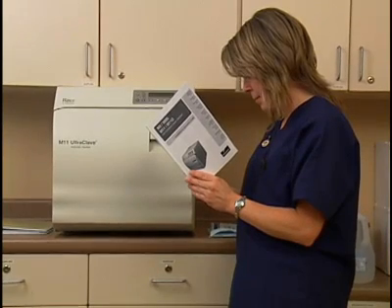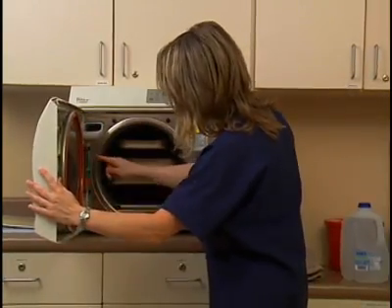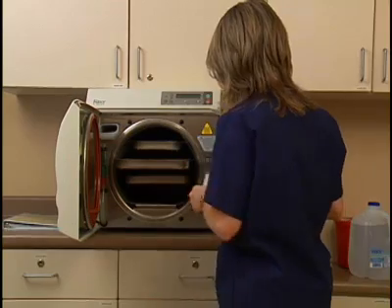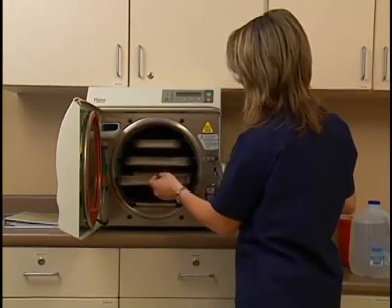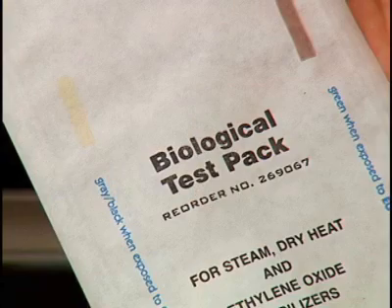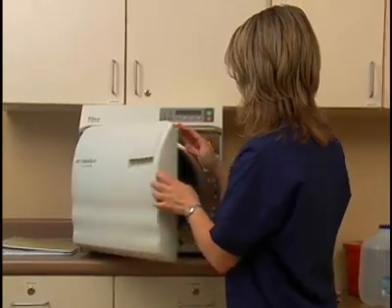Articles may be sterilized using an automatically operated autoclave. First, review the autoclave operation manual. Check the level of water in the autoclave and add distilled water if needed. Properly load the autoclave. For this load, pouches of surgical instruments will be sterilized along with the biologic indicator. Place the pouches on the tray with the paper side up and the plastic side facing down. Close and latch the door.